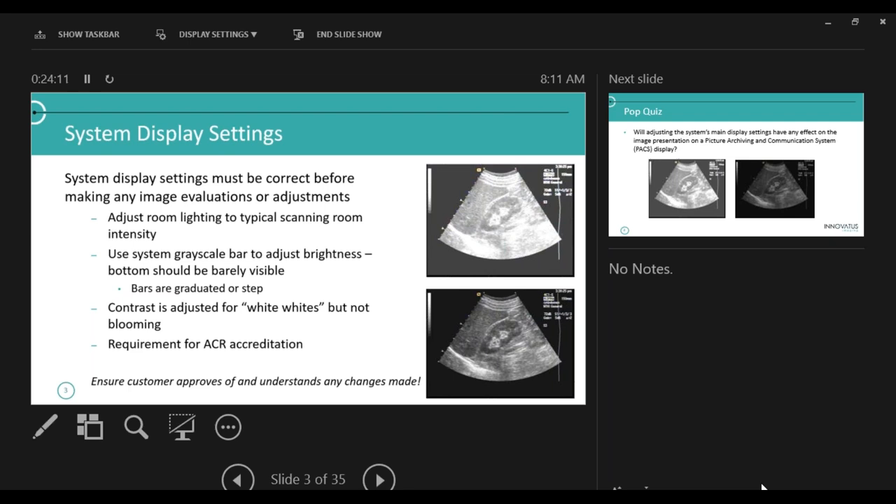Proper monitor settings is a requirement for ACR. If you are American College of Radiology accredited for ultrasound in your department, you are required to check your monitor display settings and make sure they are set up correctly. What you're seeing here — for those of you who are not sonography students — is my liver, my kidney, and my diaphragm. I have what's called kind of a glass body — I image very, very well. In the early 90s, AccuSan actually used that window in an ad for their 128.